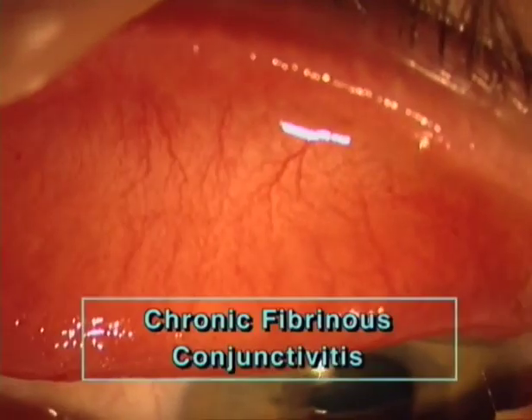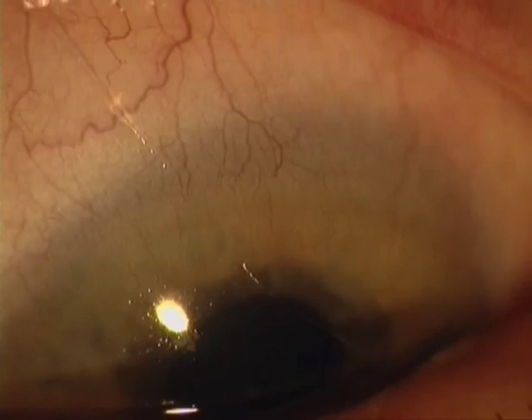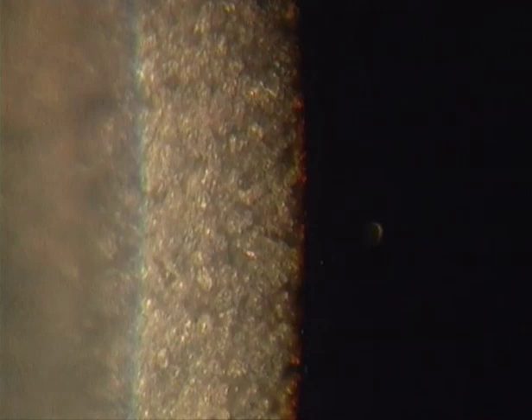In this case of chronic fibrinous conjunctivitis, except for a superficial vascular invasion, the cornea looks normal. However, the specular reflex of the epithelium, seen here without a red filter to better recognize scattered light, shows an irregular pattern of grayish units. There are numerous fine, glistening dots scattered in irregular distribution, and seen here at higher magnification, some areas show larger reflecting plaques. In the center of the grayish units, we find whitish spots, which are smaller than the irregular plaques we see here.